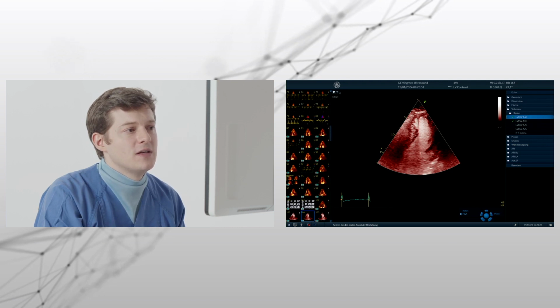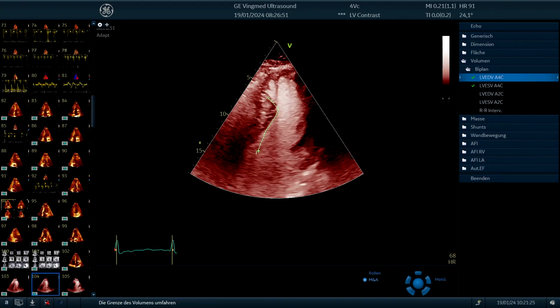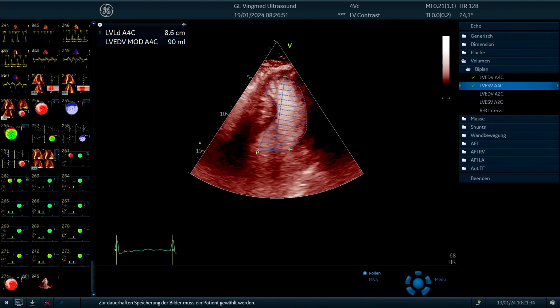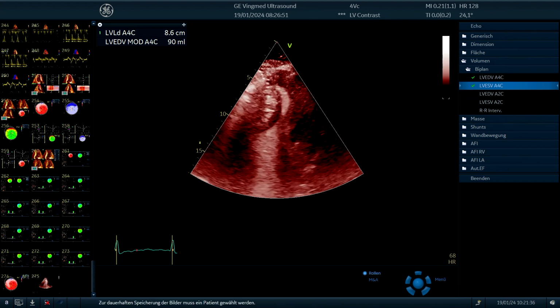because we have to see here is the mitral valve probably, and we can measure the volumes over here. So I'm doing it now rather fast for demonstration purposes, and here we have the diastolic, and here we can measure the systolic situation. And here when we take the systolic situation, we also have to focus where is the mitral valve, not overestimate, not underestimate.